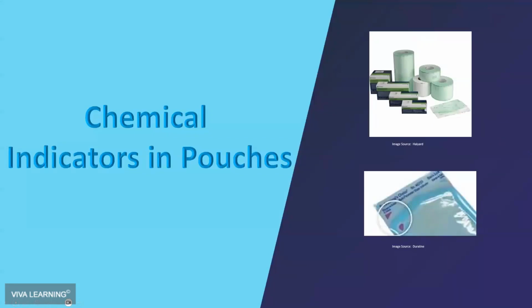And the indicator that is inside of or underneath the plastic layer of the pouch is typically the one that measures 2 or all 3 parameters needed for sterilization.